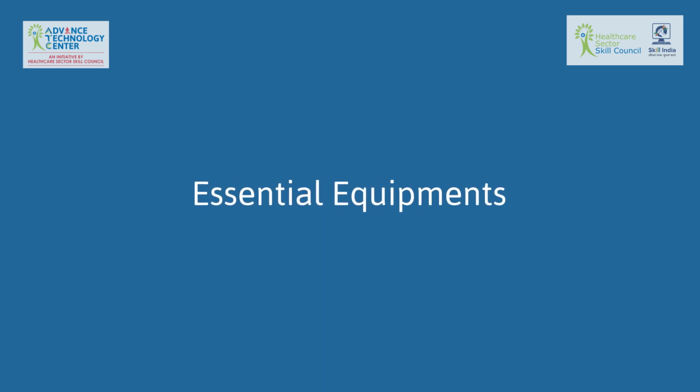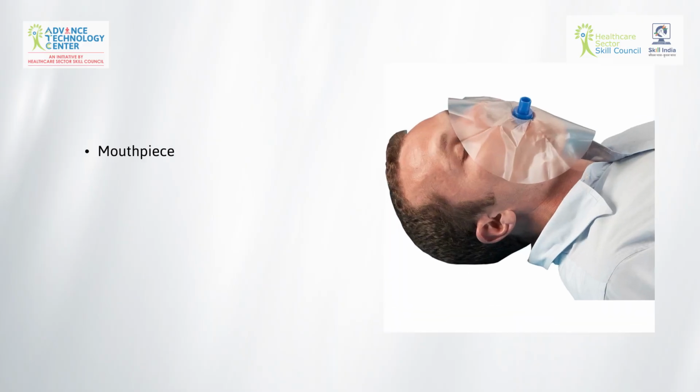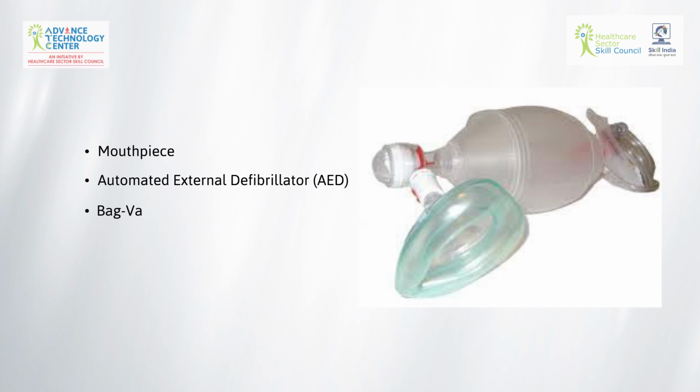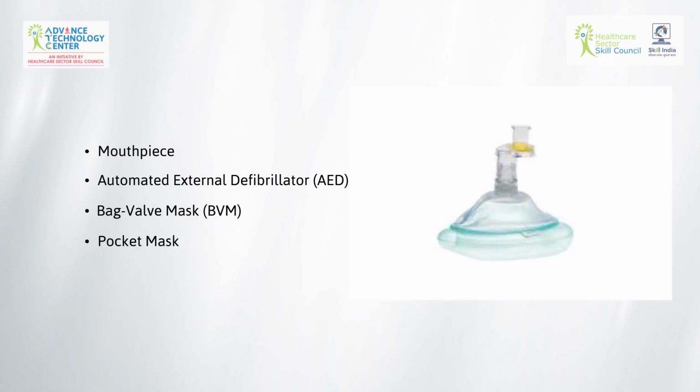Essential equipment: mouthpiece for barrier protection during rescue breaths, automated external defibrillator, AED, with adult pads, bag valve mask, BVM, for assisted ventilation, pocket mask, alternative for rescue breaths.